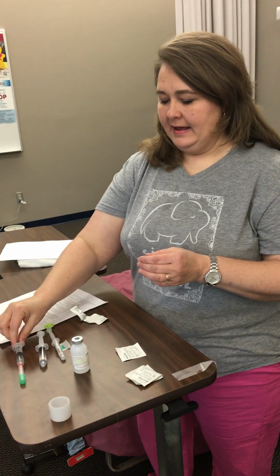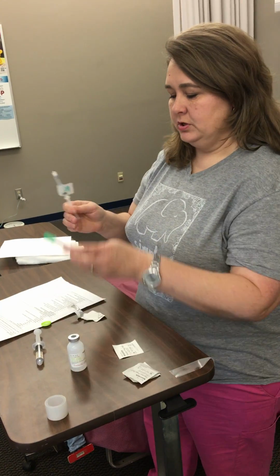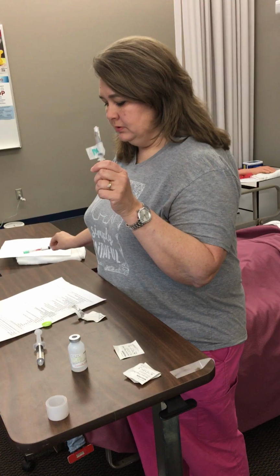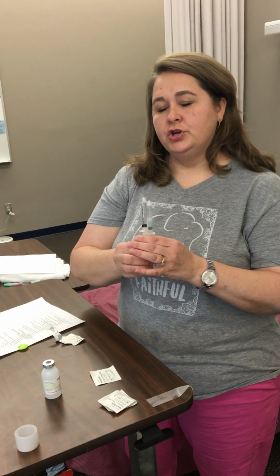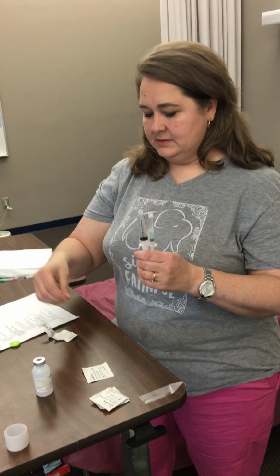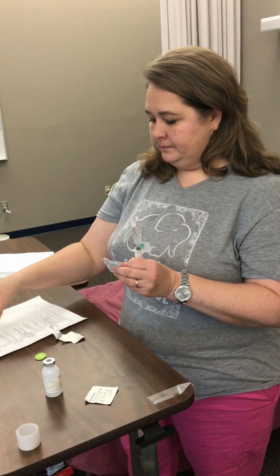All right, so I have my correct medication. I already had one pre-filled here, so I'm going to use this one that I have pre-labeled. And then I also have my flush. I'm going to demonstrate first our IV push through the INT. So at this point, I'm going to go to my patient's room. I'm going to take my MAR with me.